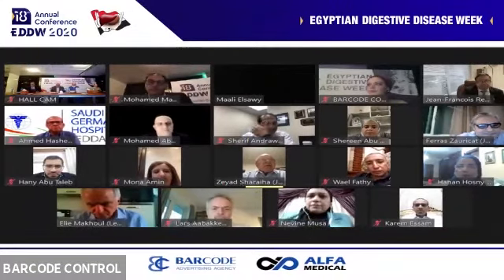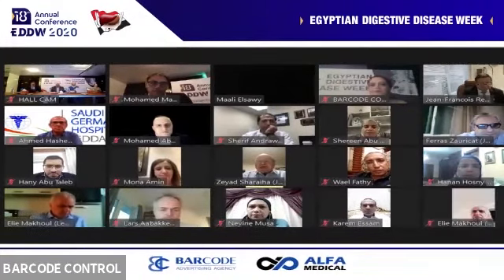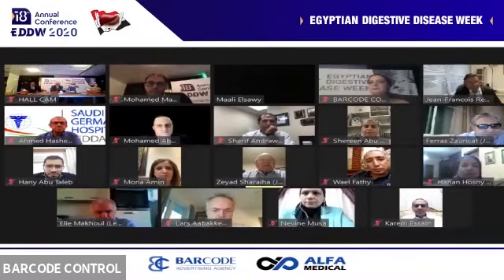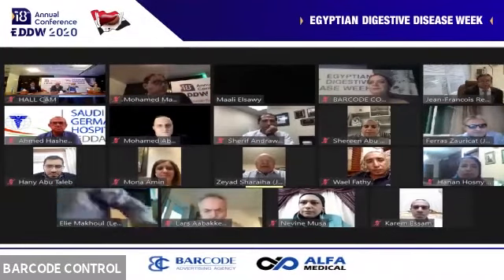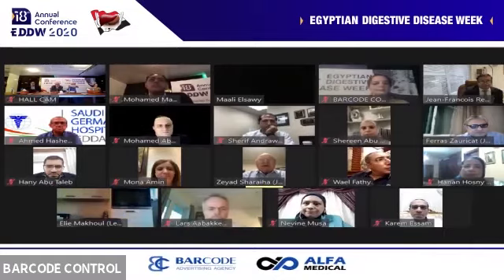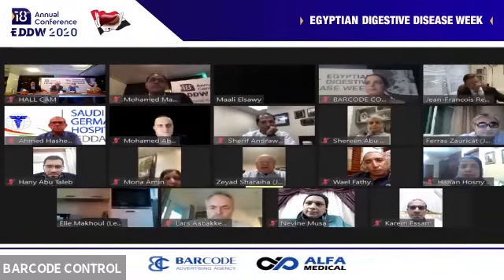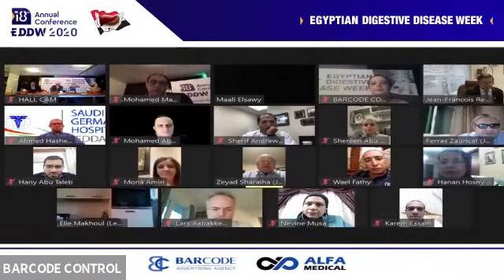I remember when we first started, I was introduced to gastroscopy. I was in England, and they were recommending to use both endoscopes, a forward-looking scope and a side-looking scope, because at that time the scopes were not malleable, and we could not see the cardia very well, and we could not see the duodenum very well. But nowadays, with these scopes, it's marvelous, and you see everything.